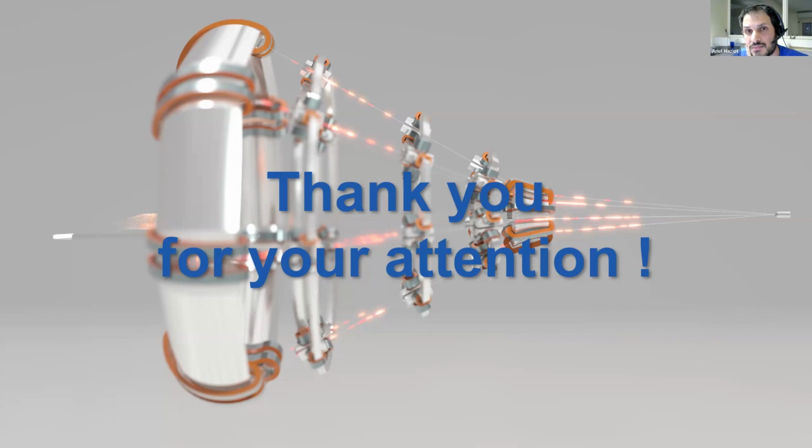So in one single pulse, imagine a static magnet, one pulse, one direction, how many protons can I give in one shot? Well, this will depend on the source on which we are plugged in. It really does not depend on this magnet, but more on the source. So, no, there are no limitations.